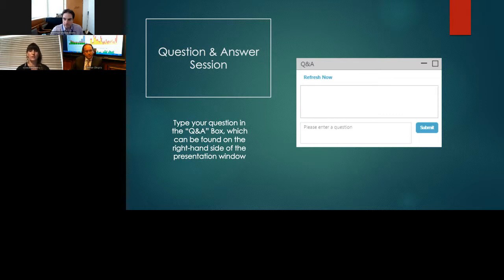And if you're going to use UV disinfection, be mindful of the environment that you're using it in and how much surface, what time does it need? What kind of lamp, all of those things. Anytime I see a video of somebody just swooping over something with it, I'm like, well, I don't think that was enough time to actually kill anything.